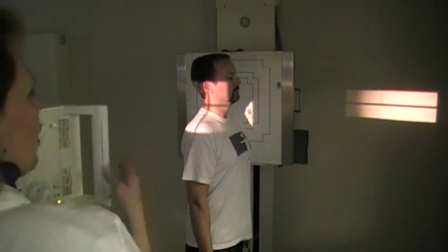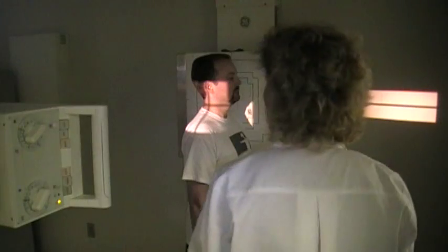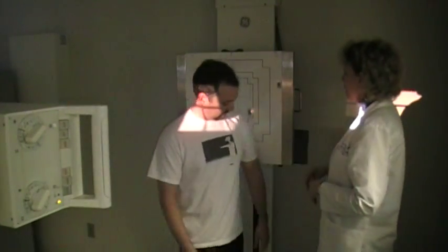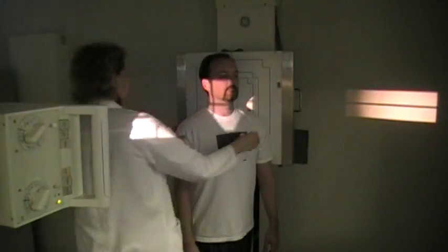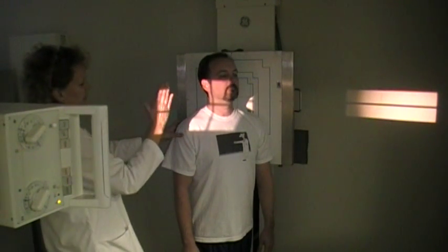So that is our lateral cervical spine. Next I'm going to do the oblique cervical spine, the AP oblique. We're going to do the left, and you're going to turn your patient about 45 degrees from where he had the left shoulder up against the board.